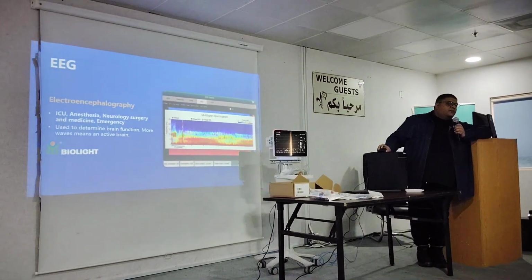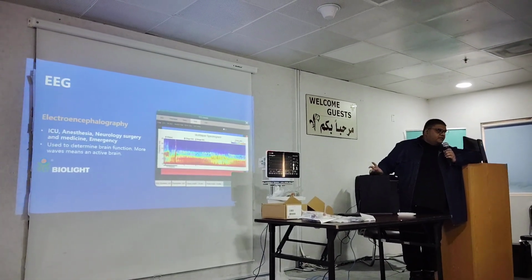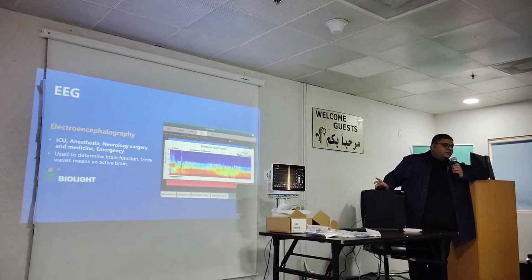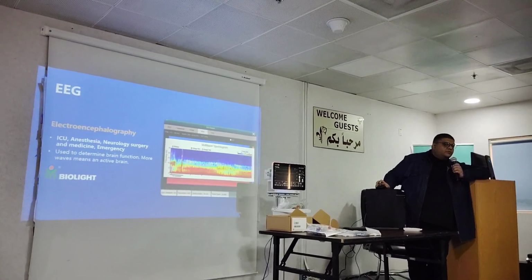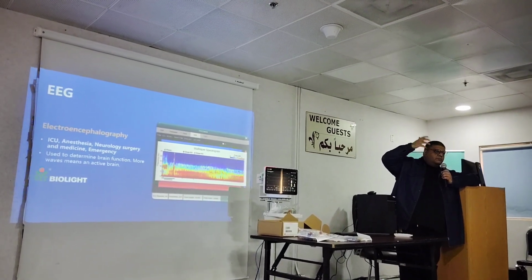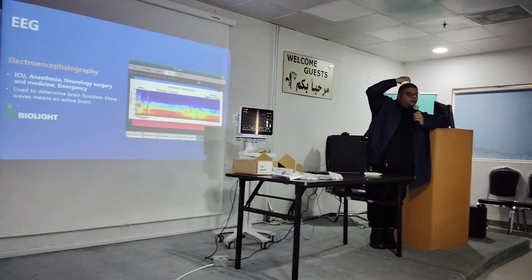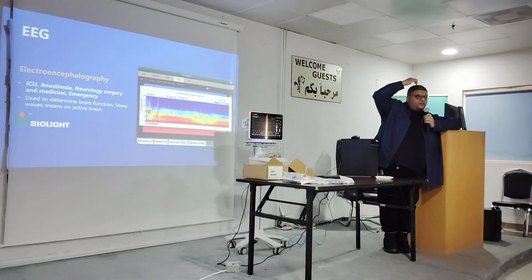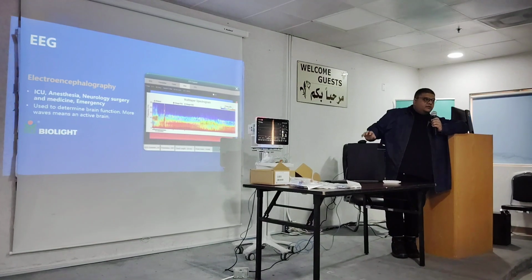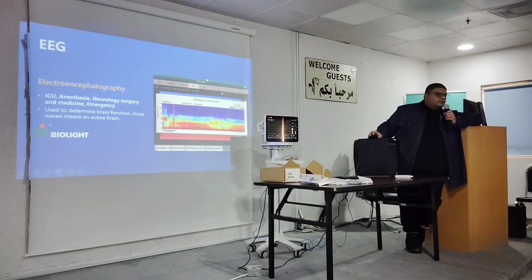For that, most of the time you would use a full EEG. This EEG only has 4 electrodes. This is for monitoring a patient. If you already know where, let's say, there's a tumor, and you have maybe a tonic-clonic seizure patient, you can put the electrodes over the area you are worried about the most and just monitor that area. You're not diagnosing the patient, you're monitoring the patient. This is a patient monitor. So this is one purpose.